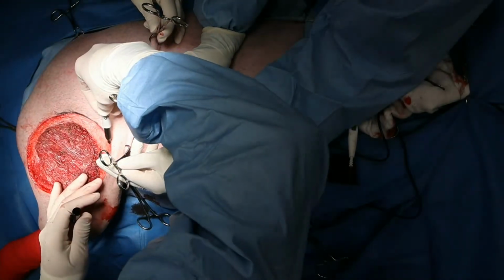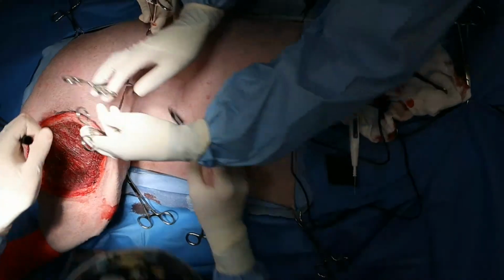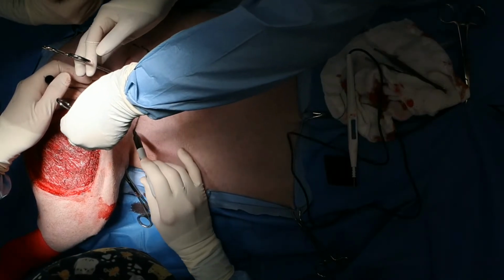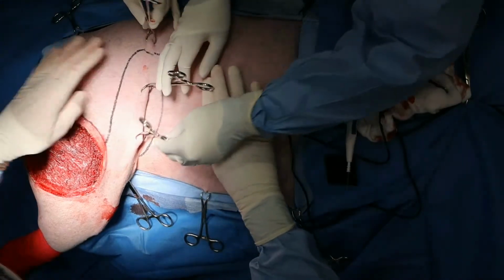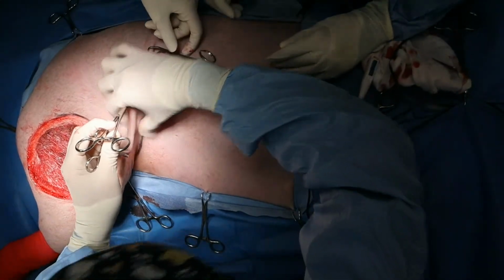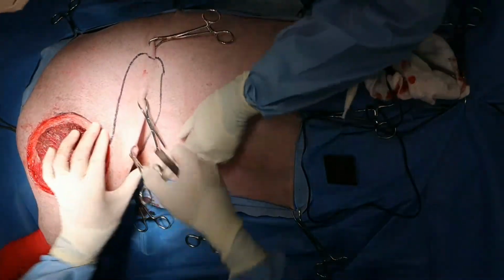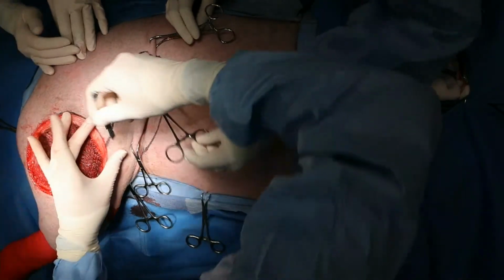And now I'm going to draw my flap, making sure that I'm going to leave enough skin behind so that I'm not going to have tension on my donor site. Let's see how that looks, and then relax that. So that'll be plenty to close the defect. And I'm checking again to make sure that I'm going to be able to close the donor site. And that length should be plenty. All right, and then this is going to have to close to that. So the biggest tension here is going to be right at that corner, right there.